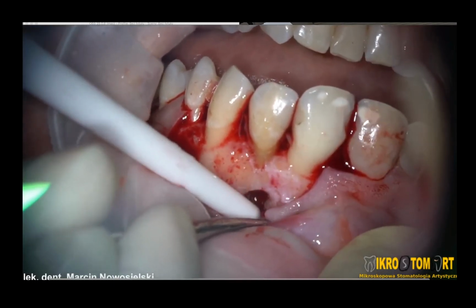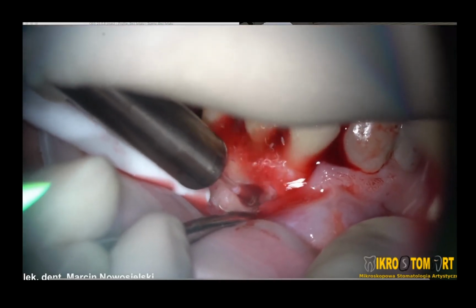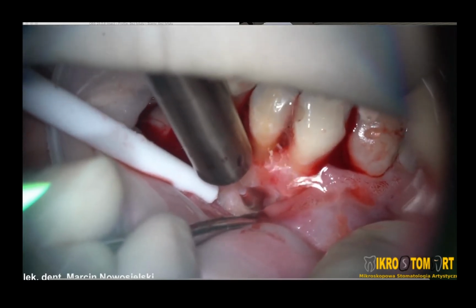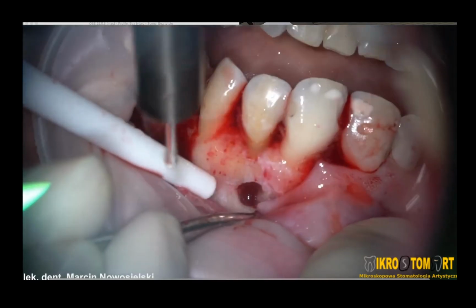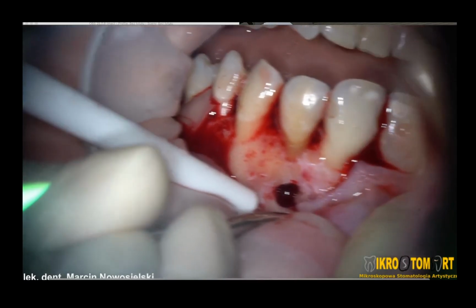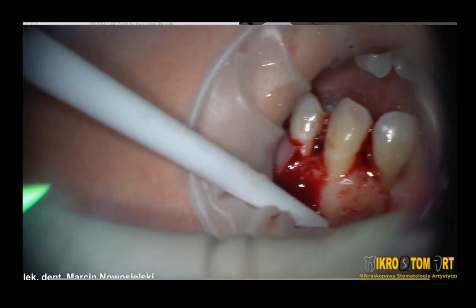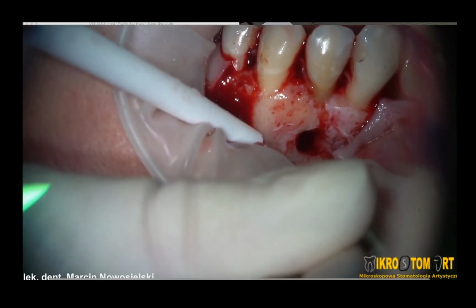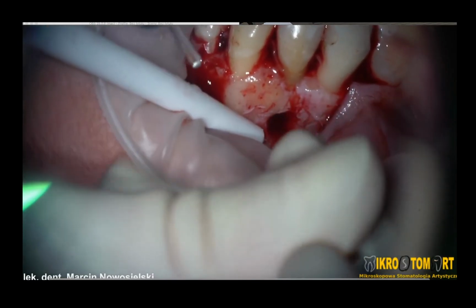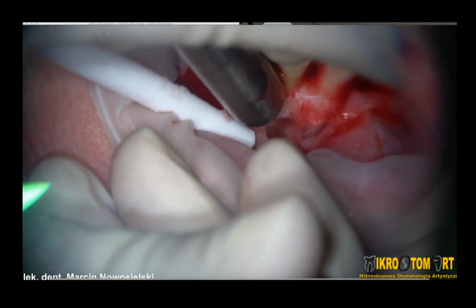So it was not very long, and in fact, because of the previous root canal and filling the apex and the area of the canal with Biodentine, which sets in a couple, if I remember well, 12 minutes, we were able to skip the retrograde preparation, because we had already a fresh, brand new filling of the canal.